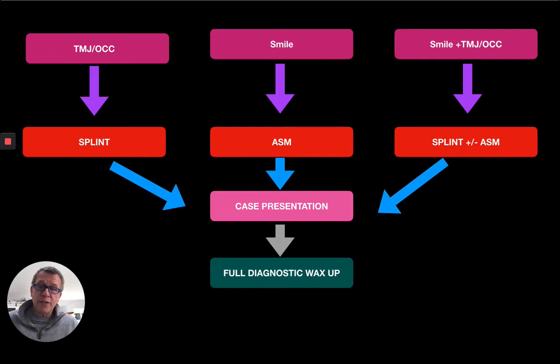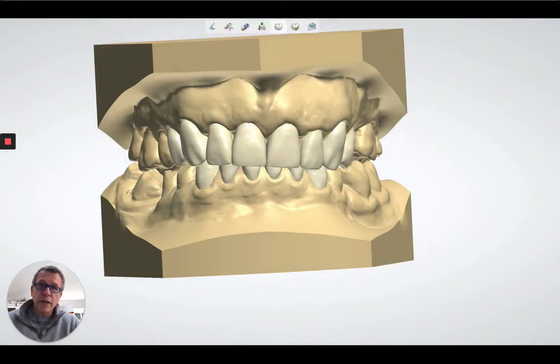So what I'm suggesting to you is, let's get them engaged, let's get them motivated. And once we've got that situation, we can present the case, and they're much more likely to go ahead with that full diagnostic wax-up. So let's just come back a little step with Ray, because this is his additive smile mock-up. And again, we can teach you how to do this. This was done by my friend Shemek from Cosmodent.